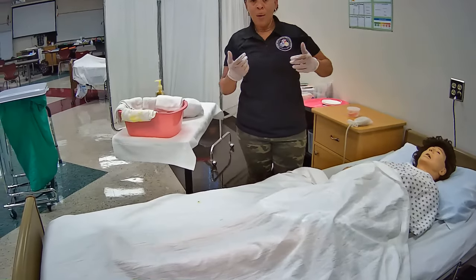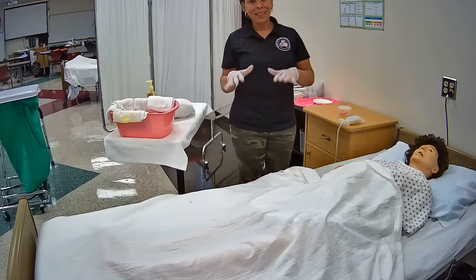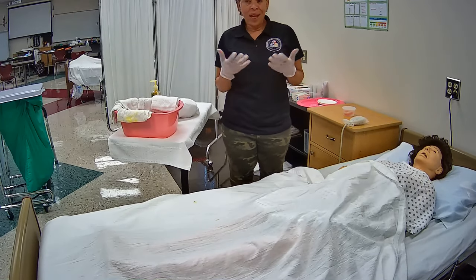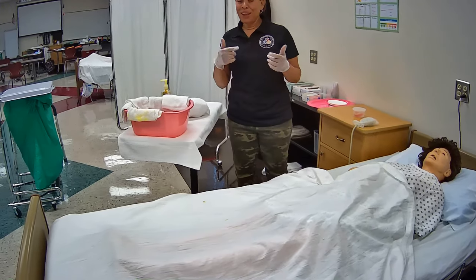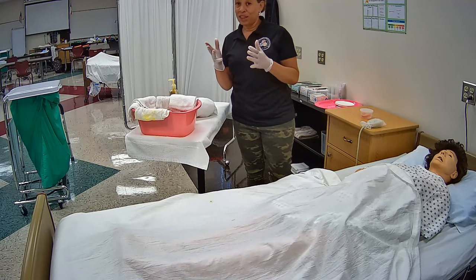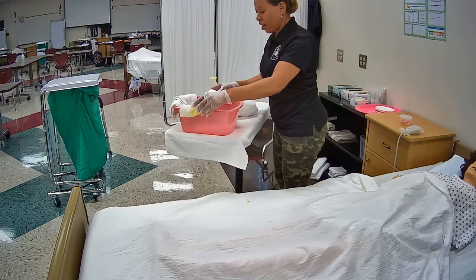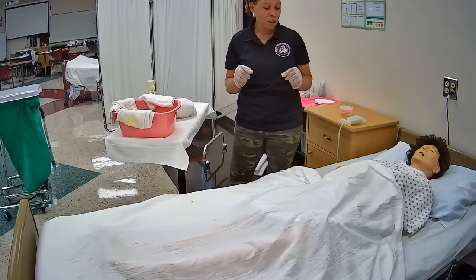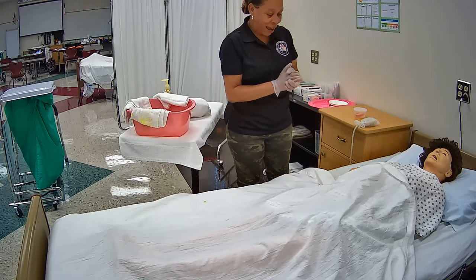When you use your elbows to do this, the NAE may say you don't have to use your elbows — just use your hands. If they tell you that, then just use your hands. But to begin with, I train my students to use their elbows because I don't want them to get flagged for infection control. Before I dispose of everything, I'm going to do my closing procedures. Mrs. Jones, I have finished cleaning your catheter. Your bed is still in a low safe position, bed wheels are still locked, you still have your call light in your hand, privacy is maintained. I'm going to go dispose of my supplies now.